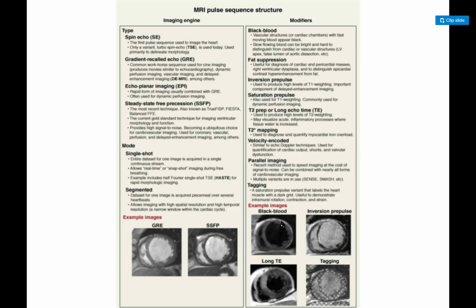I'm going to leave the inversion pre-pulse and saturation pre-pulse. What is T2 prep or long echo time? This basically means, so once you obtain the data, you are giving a pulse sequence every certain period of time, so that you will see the TE written on the MRI picture.